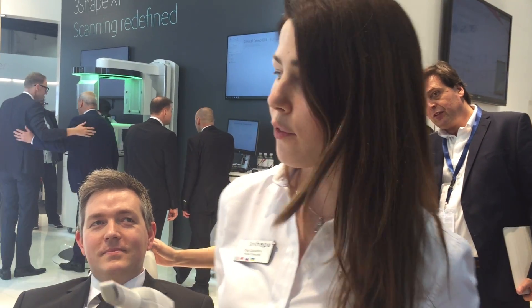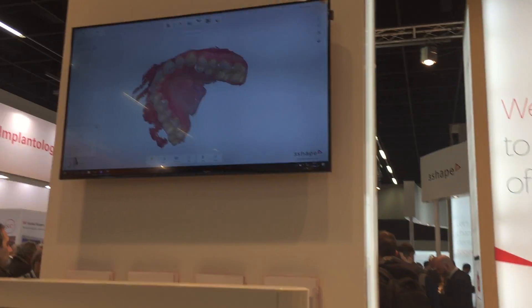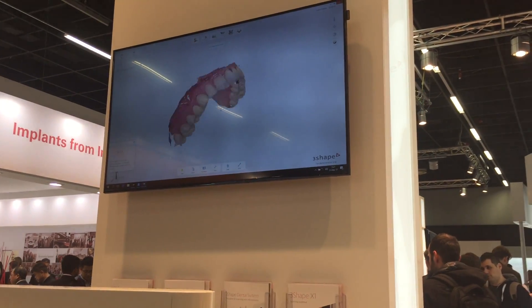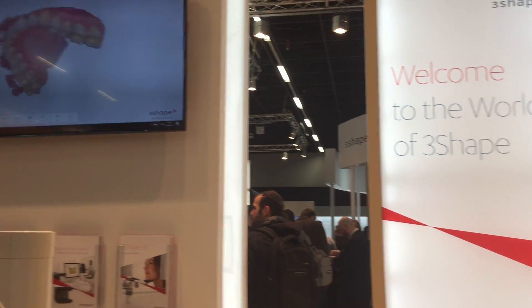As you can see, the scanner doesn't have problems scanning soft tissues or metallic optics, which enables it for any kind of treatment. You can scan for orthodontic treatment, prosthetics, or implant-based treatment of course. Now I can also use my scanner to check my impressions and see if there is anything that I missed. I just move my scanner and check all the details that I need.